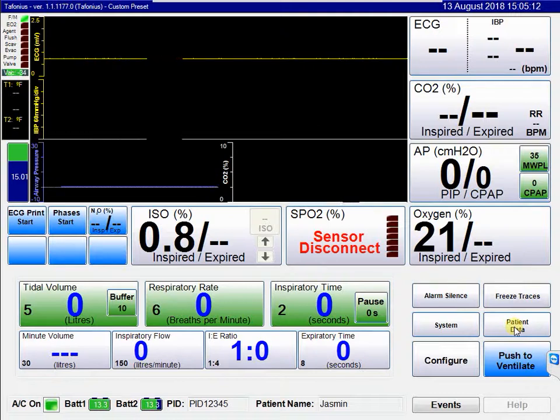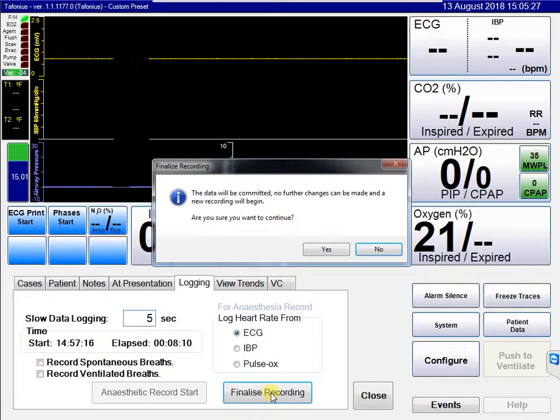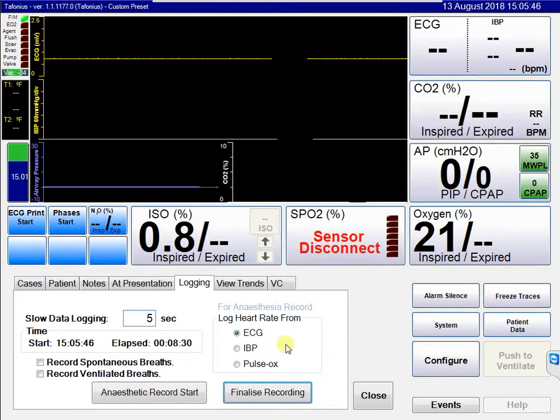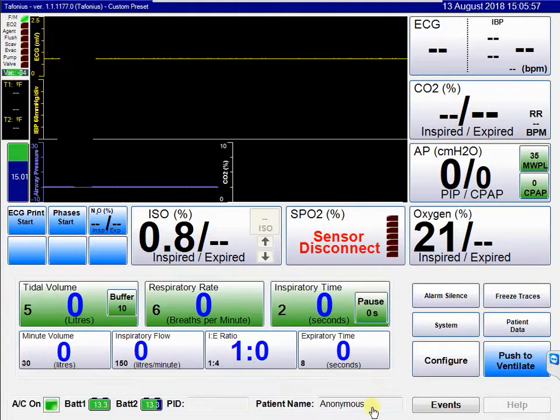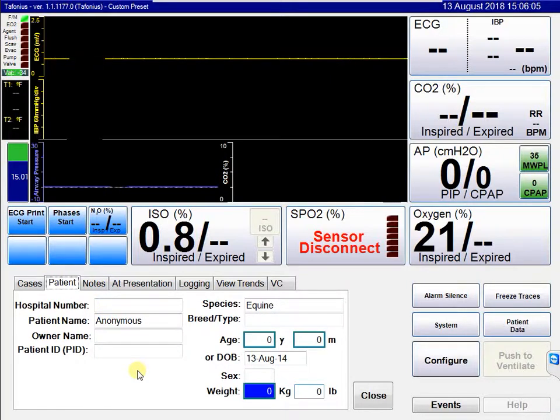Finally, in the logging tab, when you finish your anaesthetic and wish to finalise the data, click on finalise recording. You'll be asked whether you want to close the recording and make no further additions — say yes. You'll then get a summary of all the information entered previously, including notes, hospital numbers, and the owner's name. Click accept and the data is saved. You are then returned to the screen with both the anaesthetic record start and finalise recording buttons available. Closing this option returns the patient name to anonymous, and you would go back into patient data to set up details for the next patient.